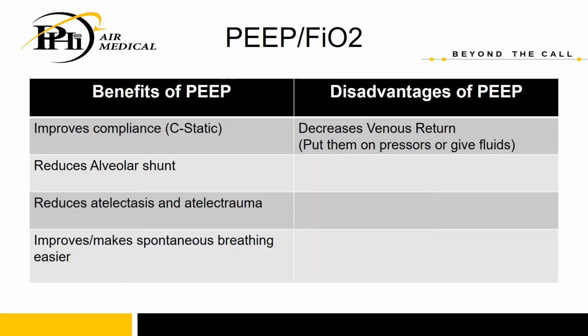So the benefits of PEEP, like I said, are kind of far and wide. So we have much improved compliance. If we think about compliance or static compliance with regards to PEEP, we can think of a balloon. When we have a balloon that's totally empty and we go to blow in it, that first little bit is pretty difficult to get that balloon to open up.